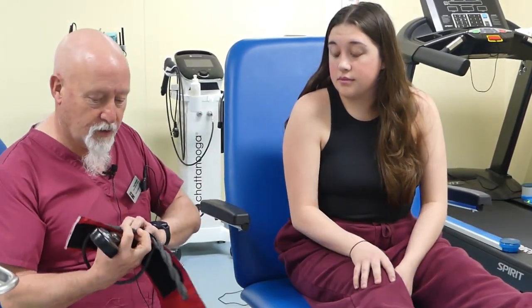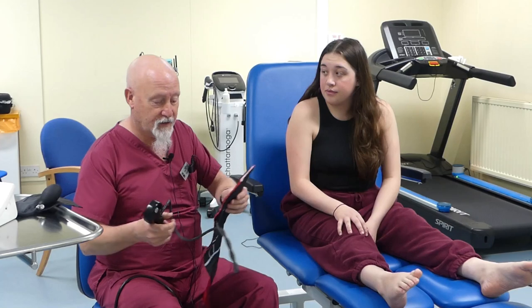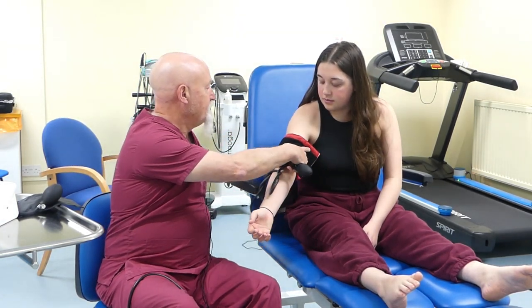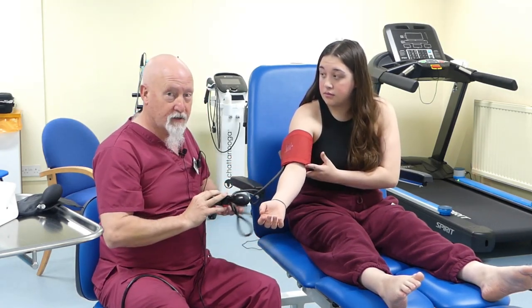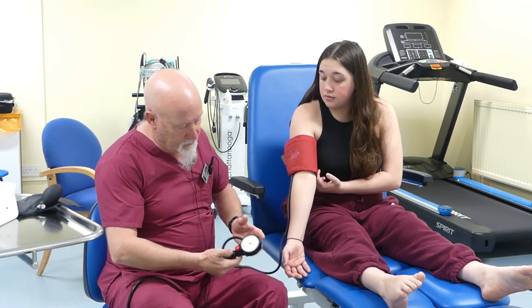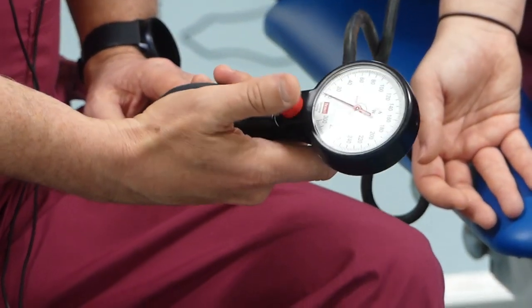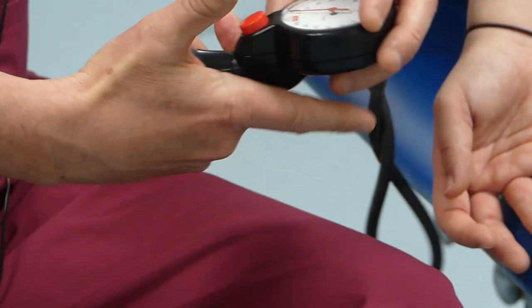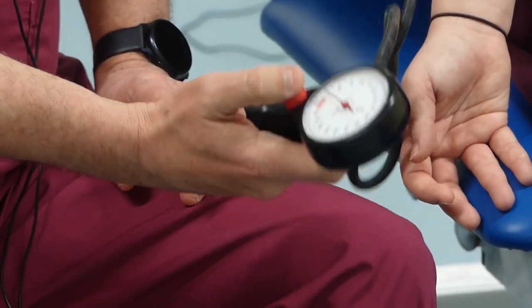This particular cuff shows on the inside that the patient-facing side is the inside, so it should be idiot-proof. You put it on and it should just go into place like that. It doesn't matter if it's tight — it's going to get tight anyway when you inflate the cuff. The cuff fits into the palm of your hand and your thumb hits this button. You inflate it by squeezing the bell against the palm of your hand; if you squeeze it any other way you might pull off this part, but this is how you ought to hold this particular probe.